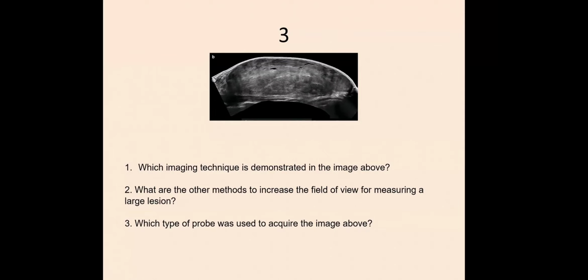These are the same probe that you are using for ultrasound of the breast. The same probe is used, you need not have some additional probe. So the same linear high frequency probe has been used.